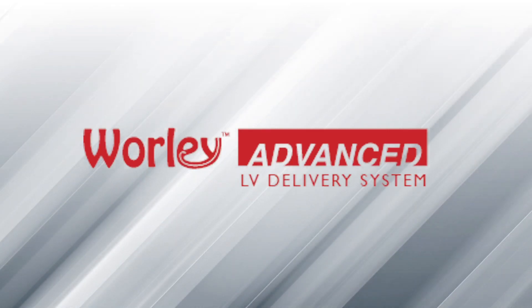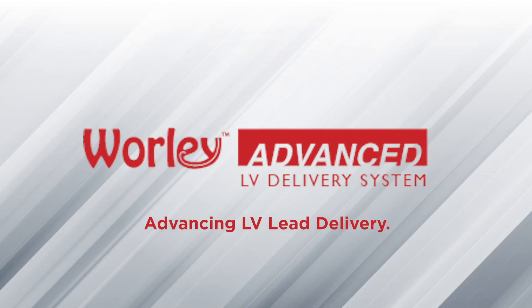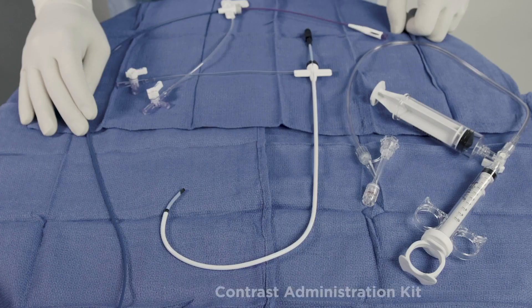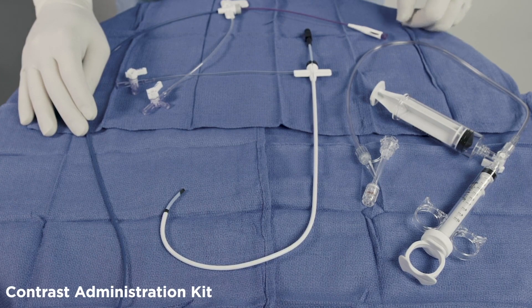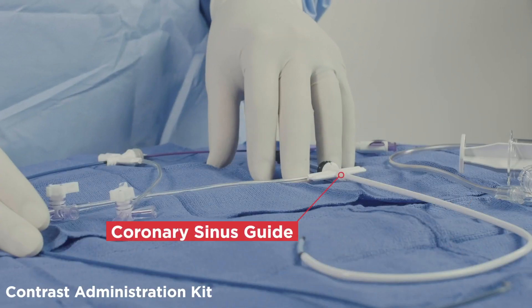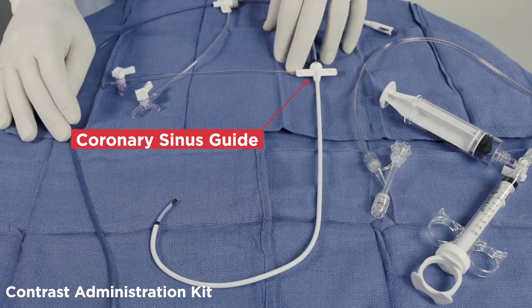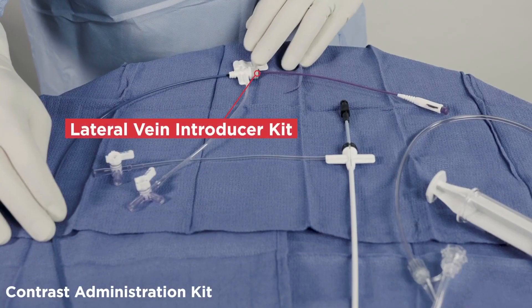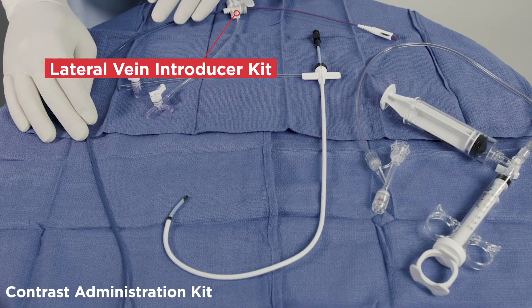Introducing the Worley Advanced Lateral Vein Lead Delivery System by Merit Medical, advancing LV lead delivery. This unique system is comprised of three fundamental components: the contrast administration kit aiding in real-time anatomy visualization, the coronary sinus guide used as vessel access and a conduit to the coronary sinus of the heart, and the vein selection kit which contains both a vein selector and a lateral vein introducer.